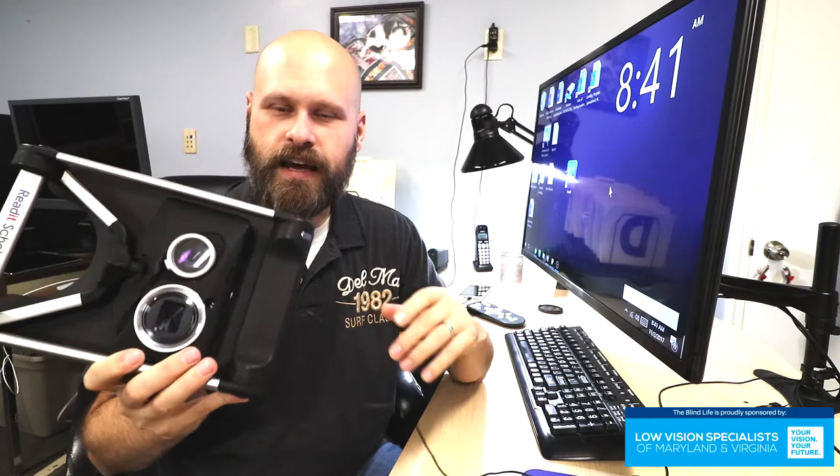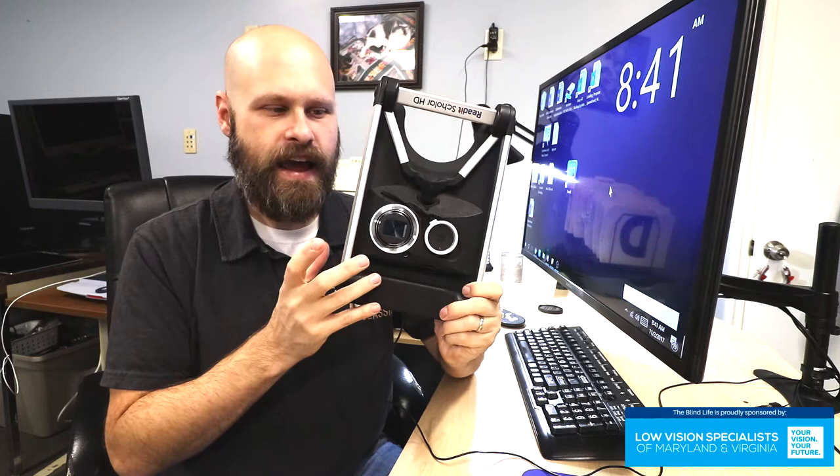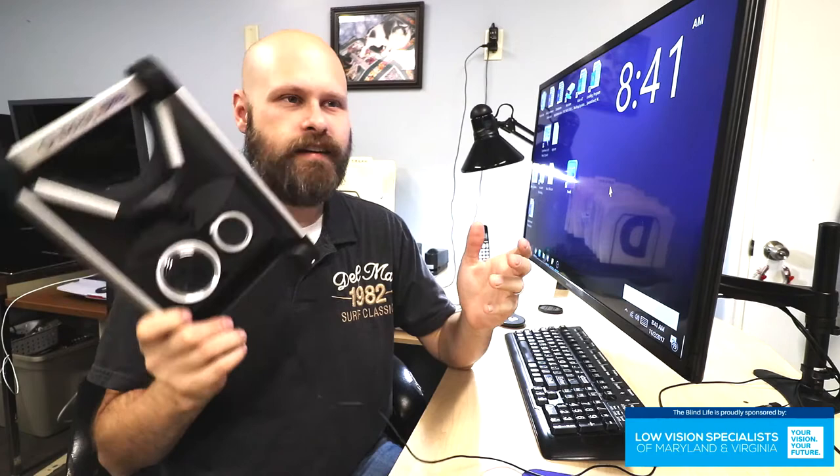When you're not using it, you can fold it down. It's about the size of a piece of paper and about two inches thick. You can fold it down, shove it in a drawer, stick it up on a bookshelf somewhere, get it out of the way, and only pull it out when you need it. So it's a desktop digital magnifier, it's going to zoom in, zoom out, and it's going to have the different colors — you can invert the colors.